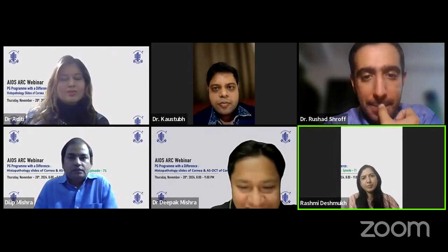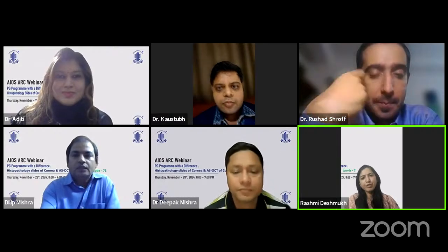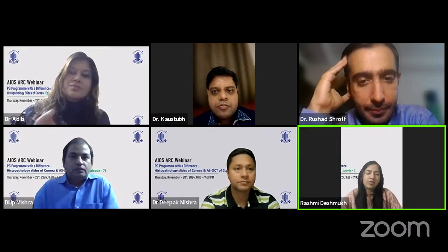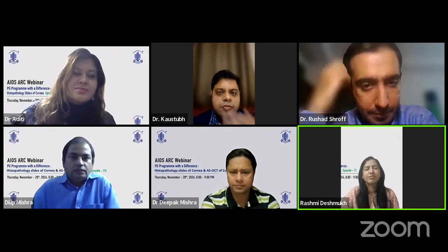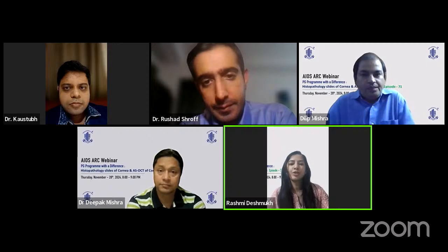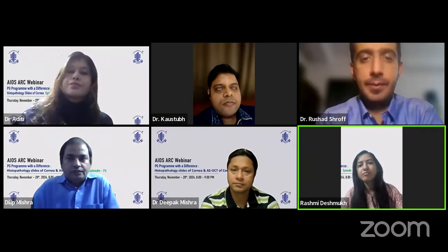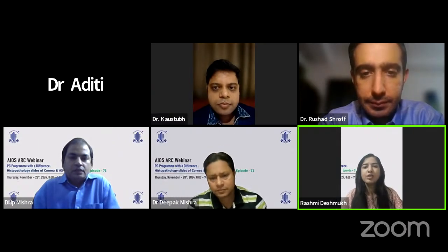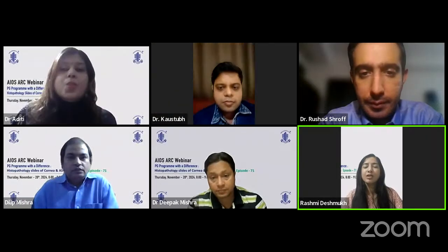Yes, I think Rushad has covered it pretty comprehensively, going from indications and going from anterior to posterior, including grafts, dystrophies, as well as the refractive applications. And particularly from a postgraduate perspective, the points he made are important, about how to differentiate between scar and corneal edema, what the different layers of the cornea are and how you're supposed to identify them, which of them will be hyperreflective, and how the fluid pockets are hyporeflective. And some of the important spotters or OSCEs that are usually shown include corneal scars. They do include LASIK flaps.